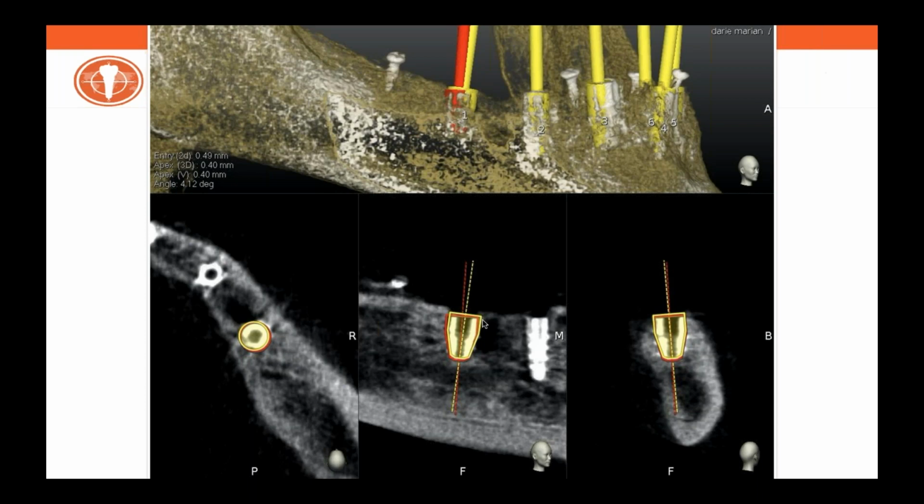So it's a great learning experience, of course, only if a second CBCT can be taken on that specific patient. But there's another set of options available, which is, of course, related to research, to literature.